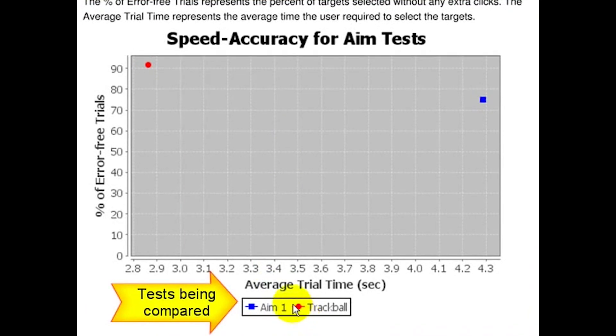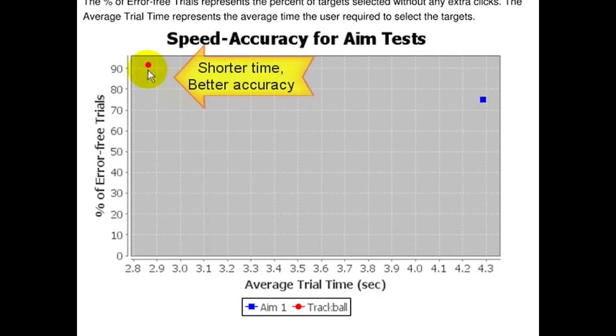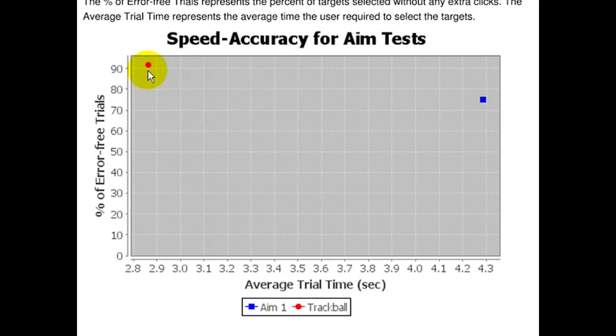Tests with better performance are in the upper left of the graph, showing shorter time and better accuracy. In this case, the trackball test shows better performance.